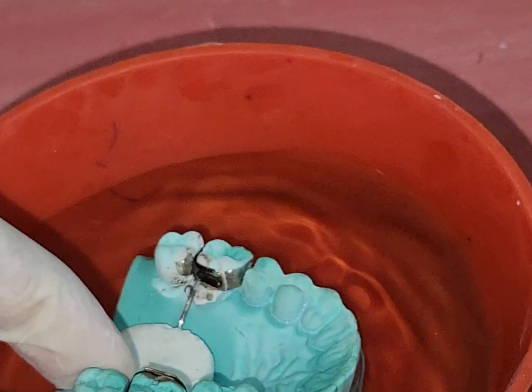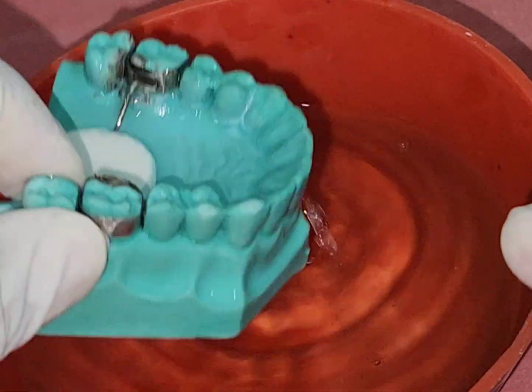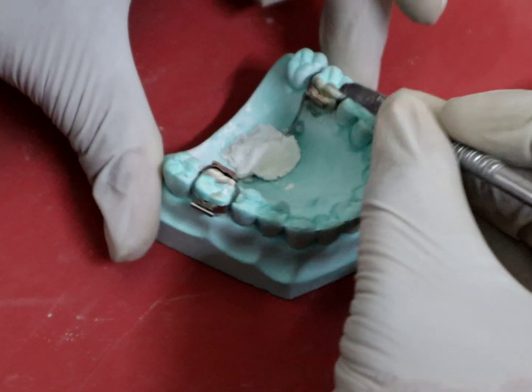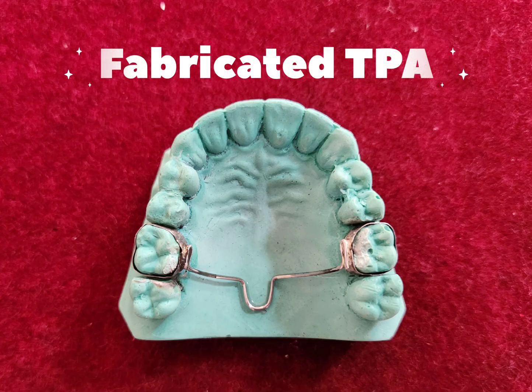Once the solder joint is formed, it is quenched in water. After completion of finishing and polishing, the process is complete.